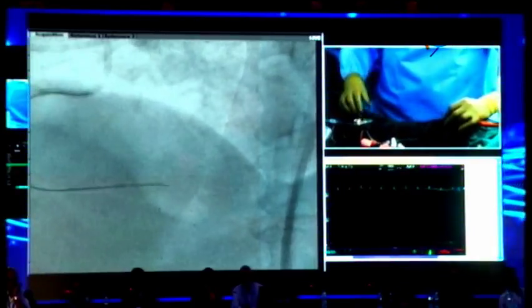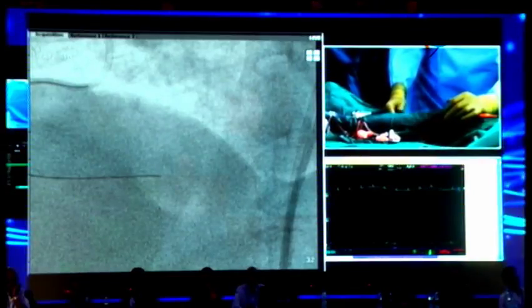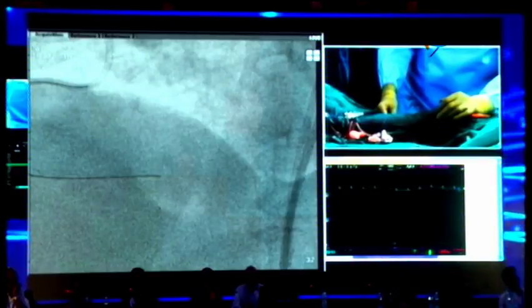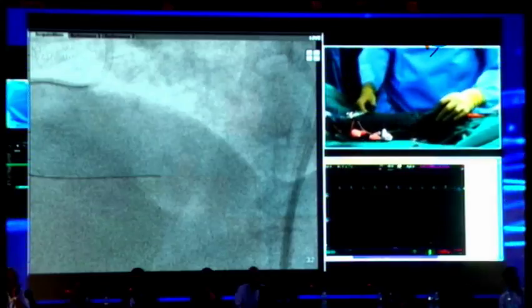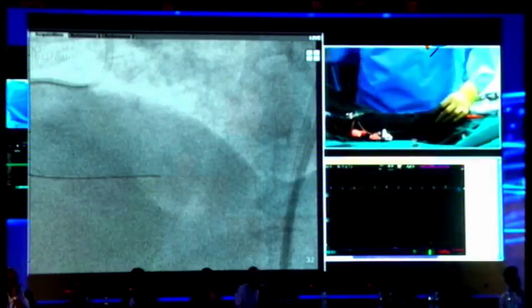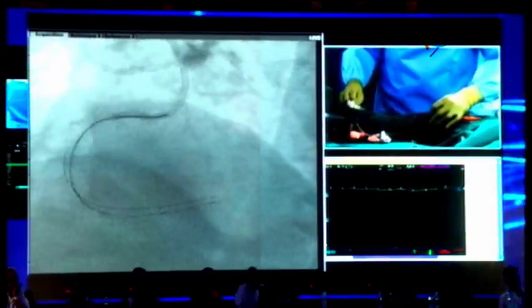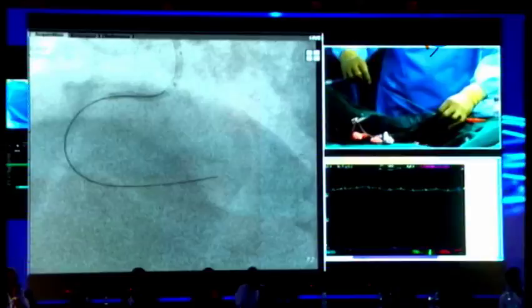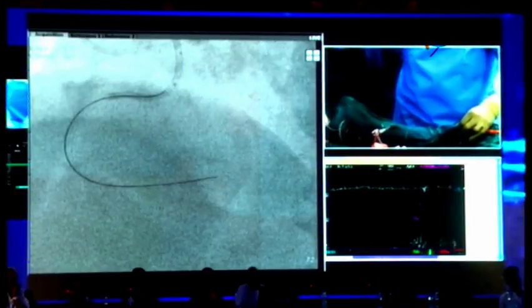Okay, fine. Go 15. I'm going to do this purely for educational purposes for the next 5 minutes. This radiation we will take care. Radiation for us? No, it's for the patient. Okay, center it. Okay, I'm going to get the trap back because it's moving forward with the balloon. Get this out. Okay, thank you.